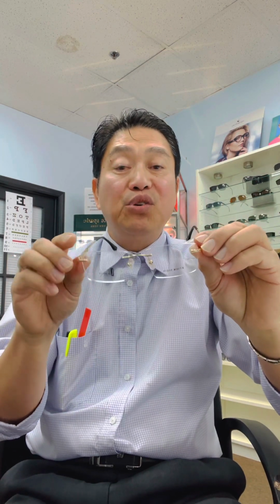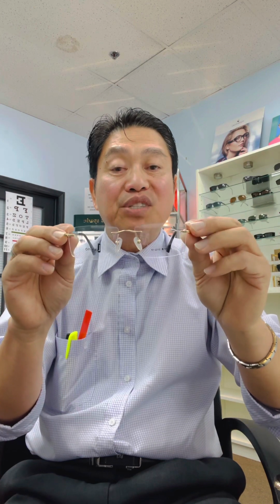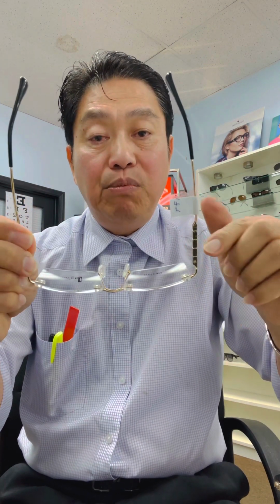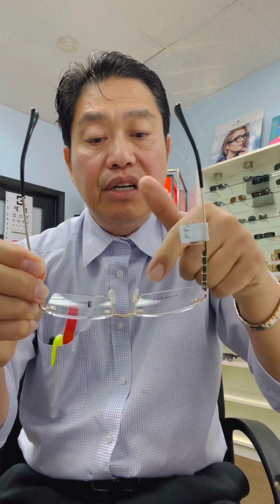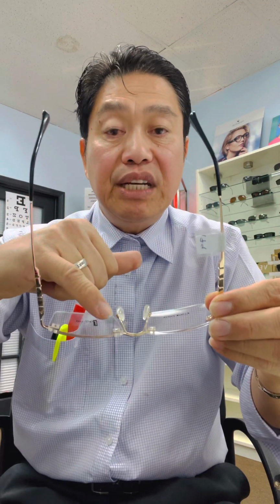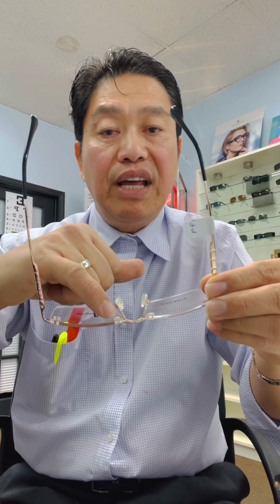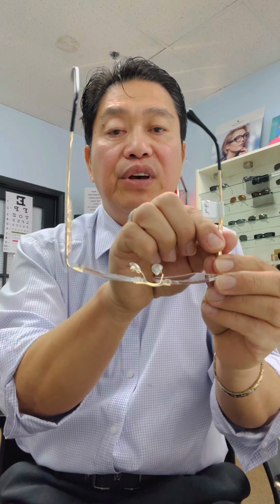So if you're choosing this one, just be very careful in handling them, because as I said, it's very flimsy. Because as you can see, there's only 4 points holding the lens and the frame. See, 1 here, 2, 3, and 4. I don't know if you can see that small plastic plug there. That's the one that's holding your lenses into the bridge of the frame here. That's why they're very flimsy.